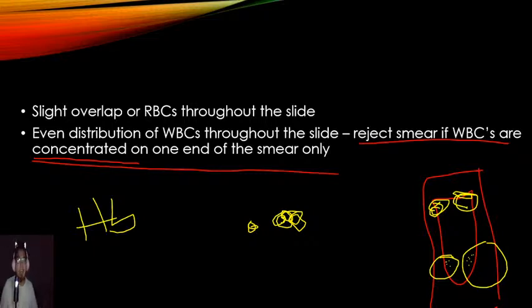Nakita ko, anong ginagawa ninyo? Gumagawa ng smear, sir. Ba't dalawa kayo? Ba't parang group effort ang paggawa ng smear? Kasi sir, hindi umabot dun sa dulo. Sabi ko, huwag nyo gagawin. Kasi napapansin ko that day, ba't parang kakaiba yung smear? Ba't parang hindi pantay? Makikita mo din naman kasi may demarcation line sa gitna yung smear. Sabi ko, ganun pala.